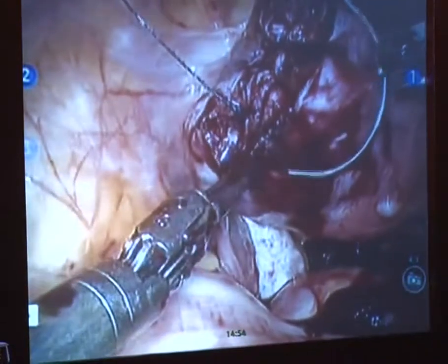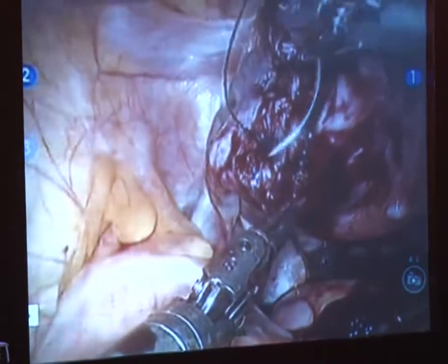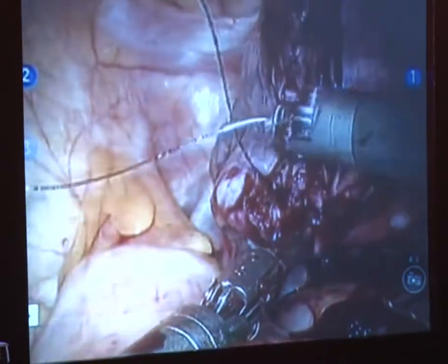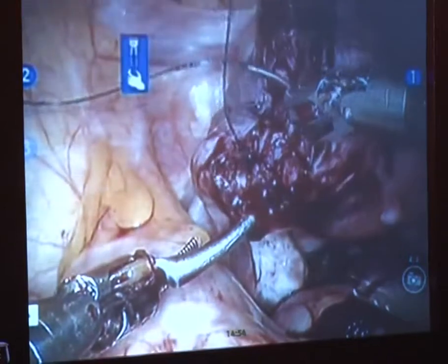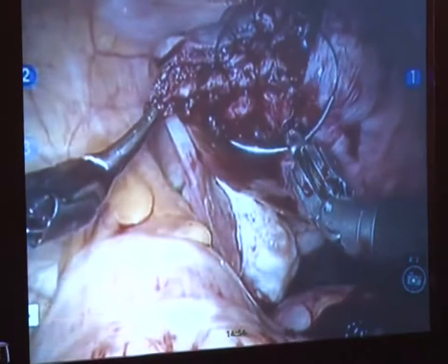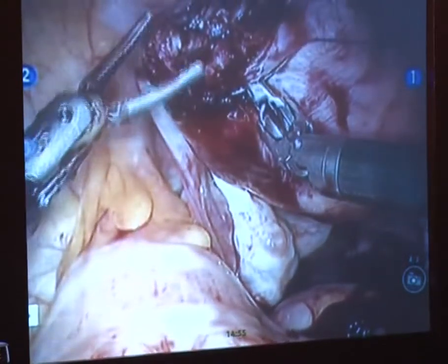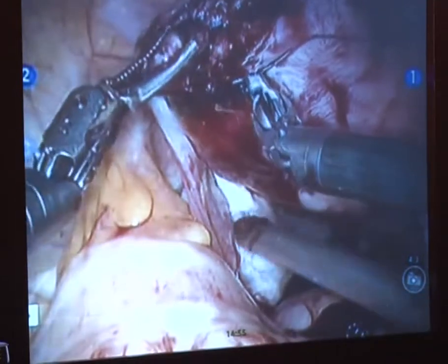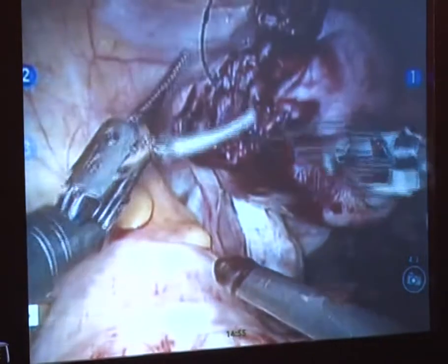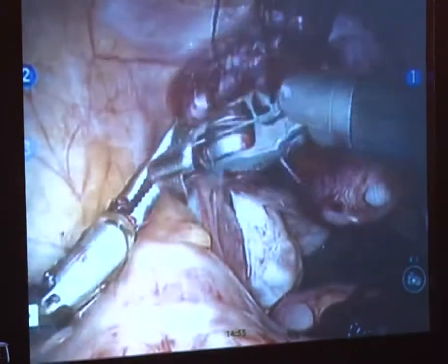I want to be cognizant of where that tube is located. Don't want to compromise it. We're pretty far from it right here. It may look close, but from a laparoscopic perspective with the robot, it's actually not as close as you would think, but we're going to be very careful. Now we're going to start on that second layer.